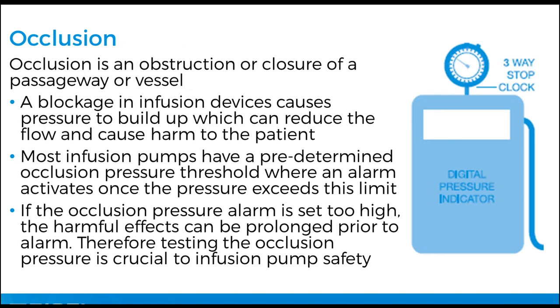Occlusion is the obstruction or closure of the passageway or vessel. A blockage in an infusion device causes pressure to build up, which can reduce the flow and cause harm to the patient. Most infusion pumps have predetermined occlusion pressure thresholds where an alarm limit activates once the pressure exceeds this limit. If the occlusion pressure alarm is set too high, then harmful effects can be prolonged prior to the alarm. Therefore, testing the occlusion pressure is crucial to infusion pump safety.